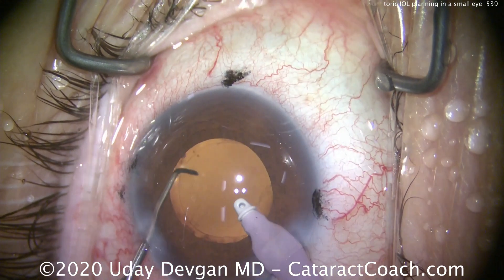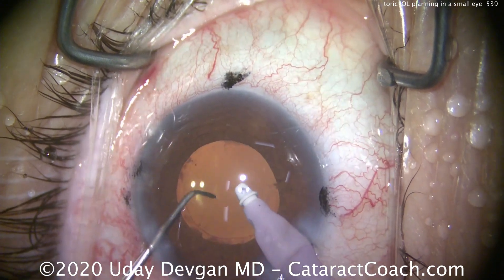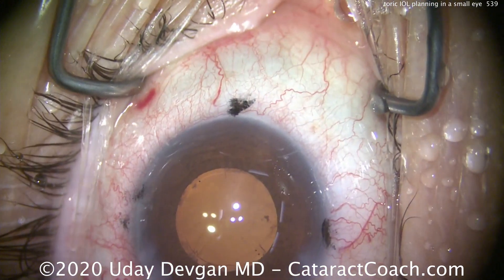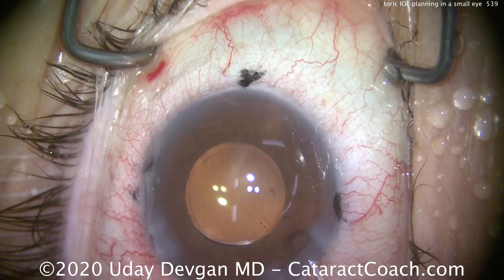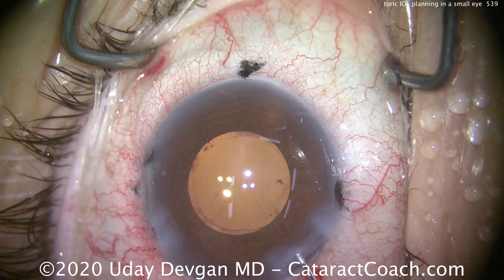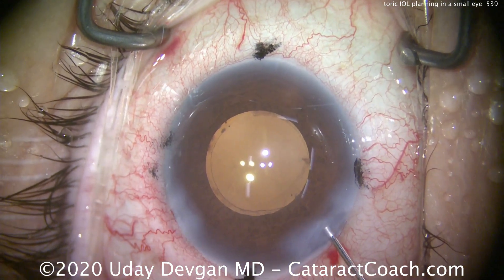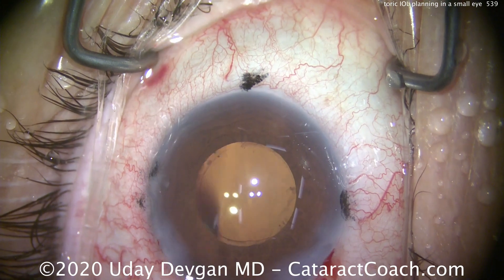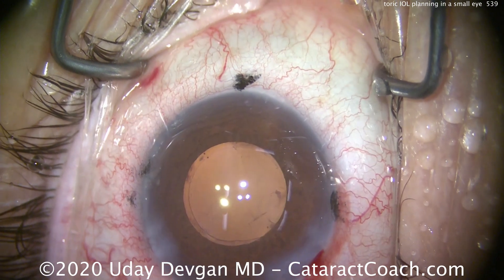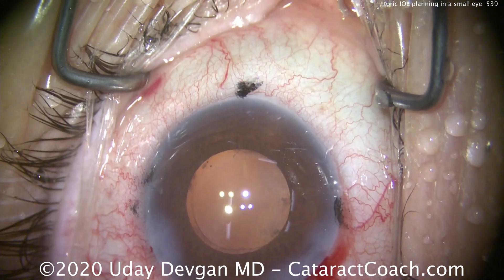Just tapping it into place — a very small movement at the very end. We don't want to over-rotate it because then we'd have to go all the way back around. This lens material is a little tacky, so wherever we leave it, it tends to stick to the capsular bag. Let's hydrate the incision — this looks great and is going to seal up beautifully. This is the patient's second eye; the first eye had a fantastic result, so we're very confident in our lens calculations. The first eye got a 29.0 diopter lens; this eye is getting a 29.5.